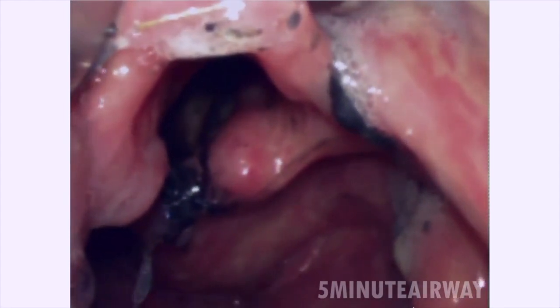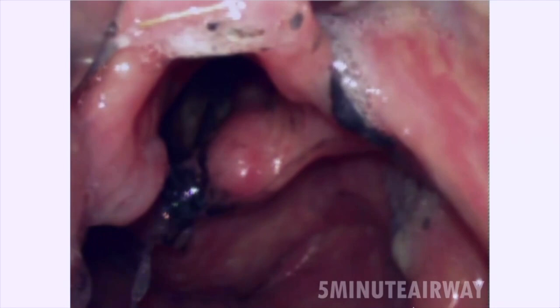How do you guys feel about this exposure? We can pause here. Not sure what the dark material around there is. That's the other thing I want to consider. I thank you for saying that, everyone. So, what do you think all that dark material is?